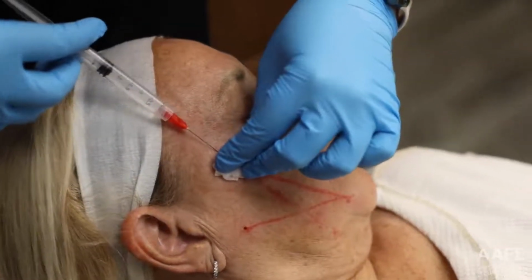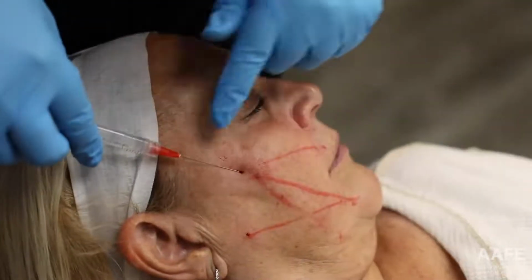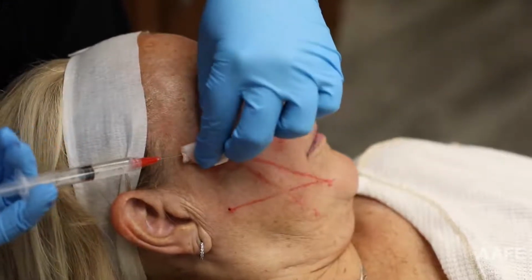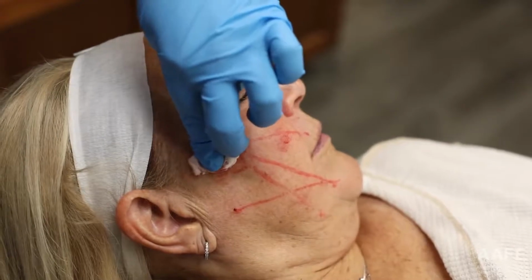And it does sting. That's kind of the worst of the procedure for the patients, is that sting from the lidocaine. Last big burn. Okay, and that's the worst of it. So now she's numb, so I can go in with the threads.